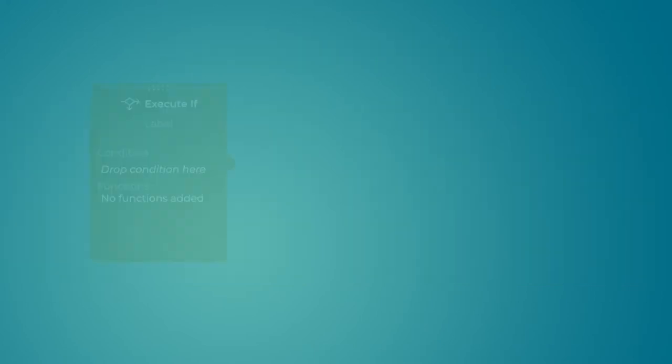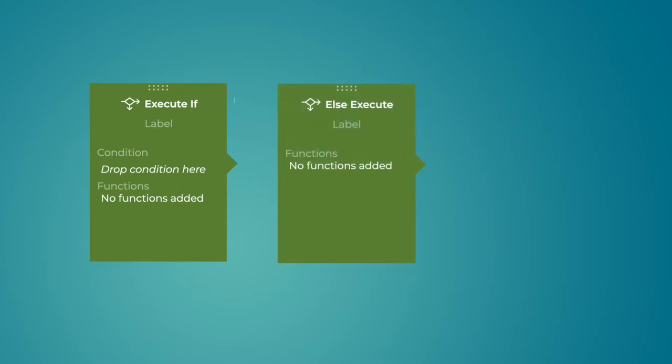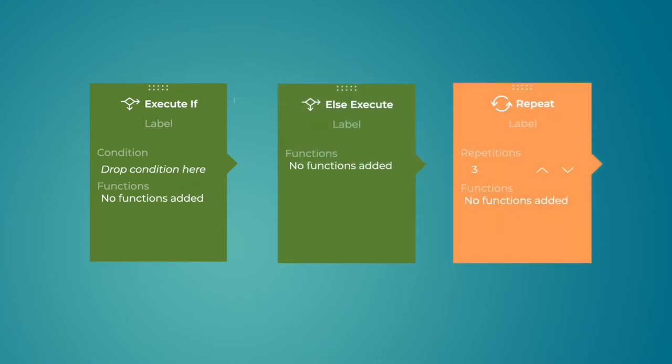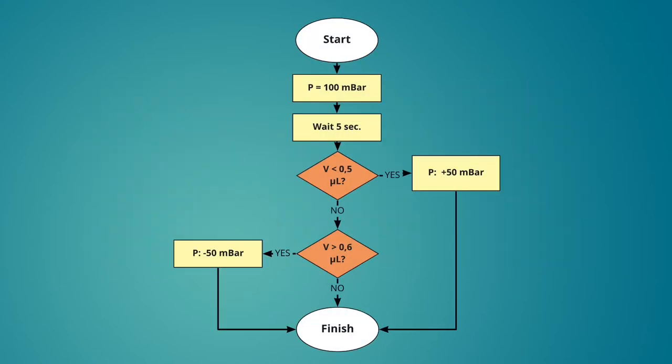We will start with the execute if, else execute and repeat blocks. Let's start with an example and the corresponding diagram.